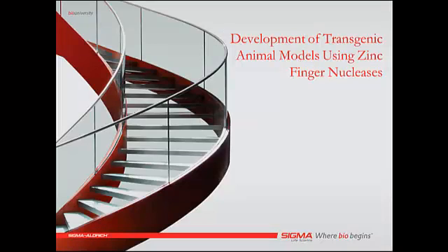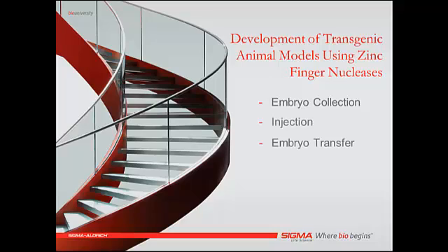In this video, we will be demonstrating the process of pronuclear injection, including embryo collection, injection, and embryo transfer with mice. Pronuclear injection will be demonstrated using mouse, rat, and rabbit embryos.